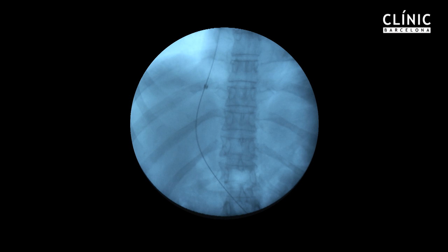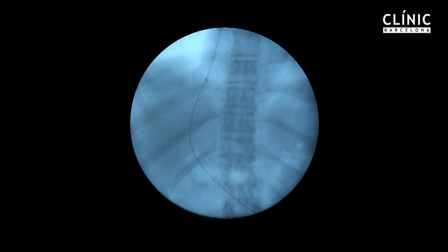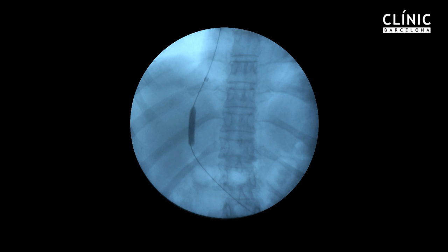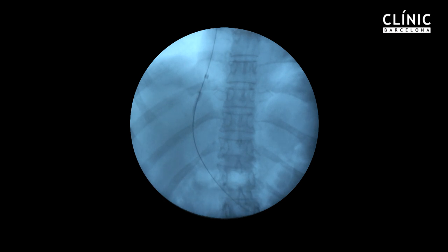An angioplasty with an 8-millimeter diameter balloon is performed, showing an indentation where the wall of the portal vein is dilated, and also at the hepatic vein level.